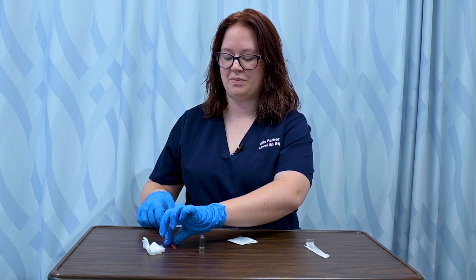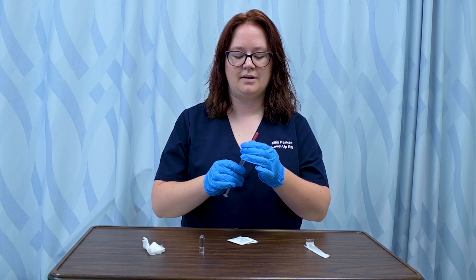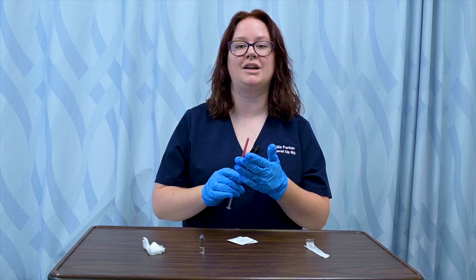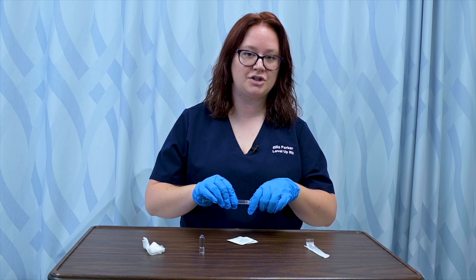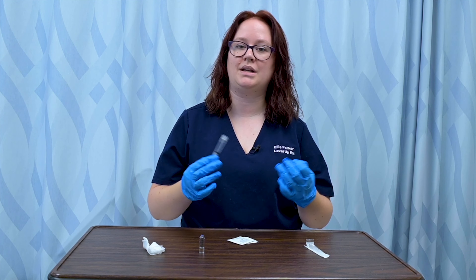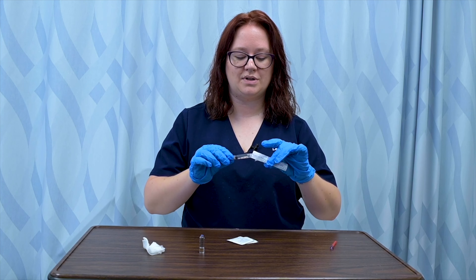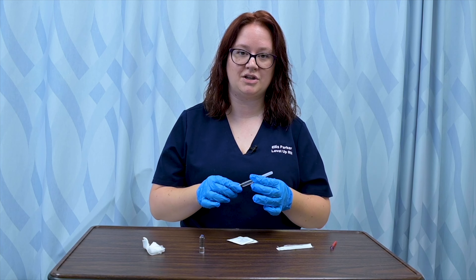Once I've gotten the correct amount, I'm going to recap the filter needle. This is one of the few times you'll be recapping — I'm using the scoop method to safely recap my needle. The reason I need to recap is because I cannot use the filter needle when administering this medication. If I'm giving it with a needle — say, an intramuscular injection — I need to remove and waste the filter needle and attach a different needle before injecting into my patient.